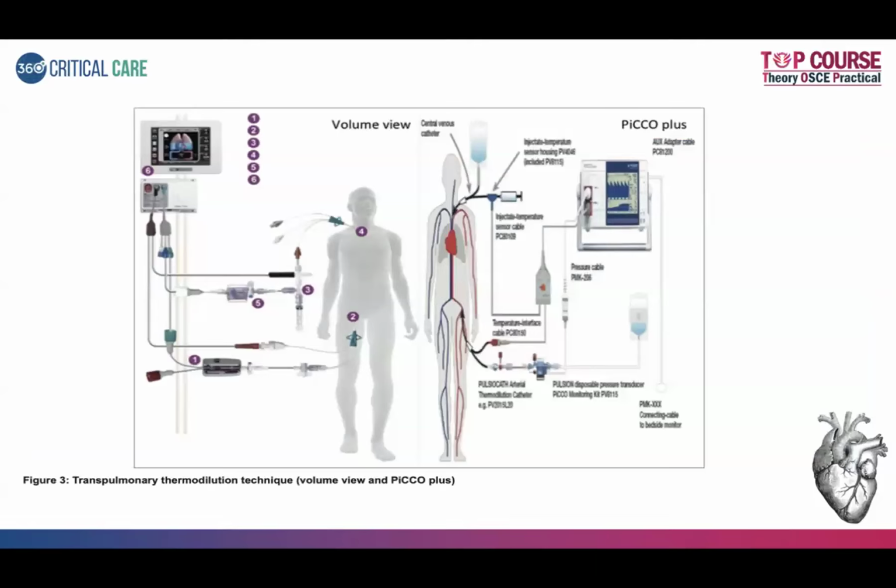So as I told you, we are using a CVC and an arterial line, and you are injecting the cold saline through the CVC, and you are seeing the change at the arterial level where there is a thermistor which sees the thermodilution technique.